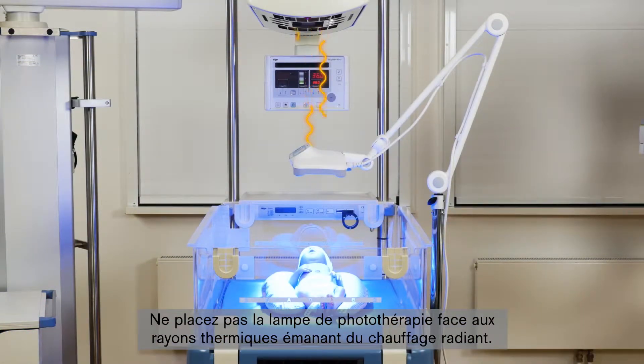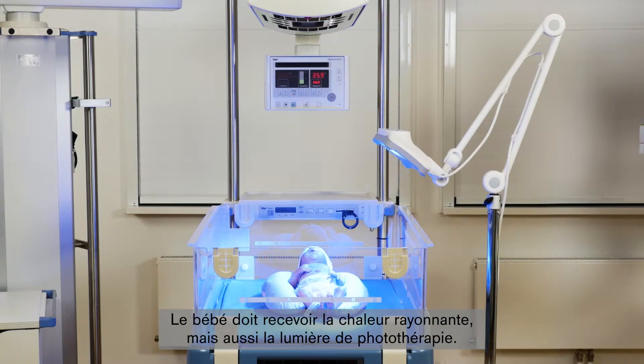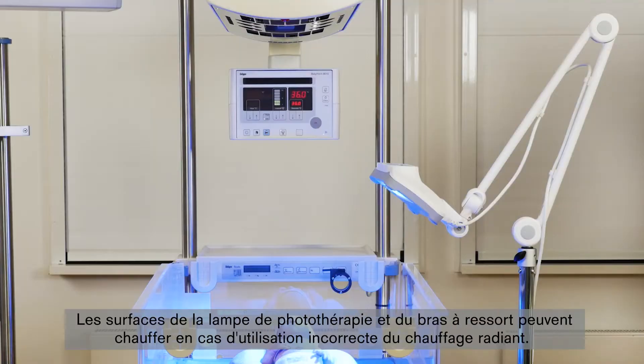Do not position the phototherapy light directly in the path of heat rays from the radiant warmer. The baby should still receive radiant heat, but also phototherapy light. The surfaces of the phototherapy light and the spring arm may become hot when used incorrectly with radiant warmers.